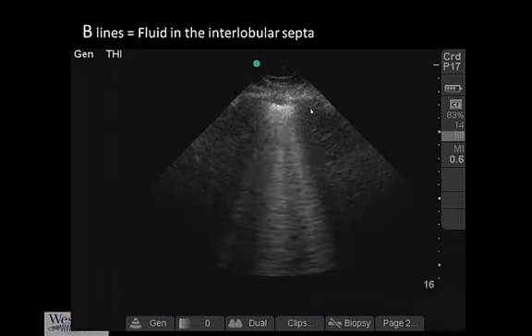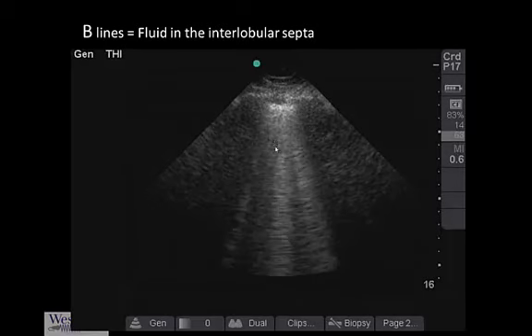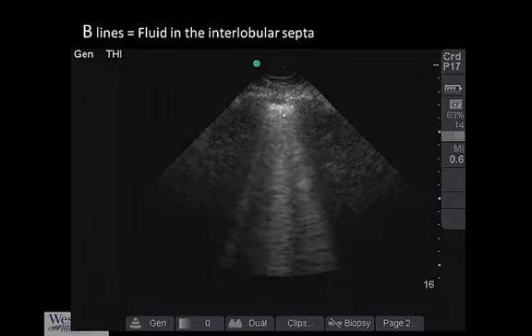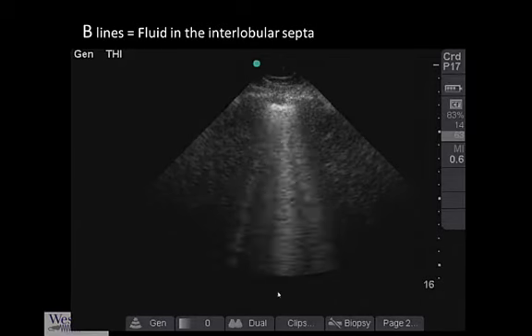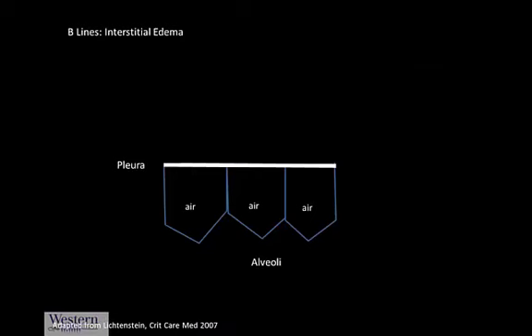You can see a rib shadow here and a rib shadow here, but the bright pleural line you see is casting these light rays or lung rockets or B-lines, call them what you like, but you can see they move with the pleural line, and they must go to the bottom of the ultrasound screen. So even if we increase the depth, you'd still see the B-lines shooting down all the way to the bottom of the screen. And let's review exactly how these are formed.